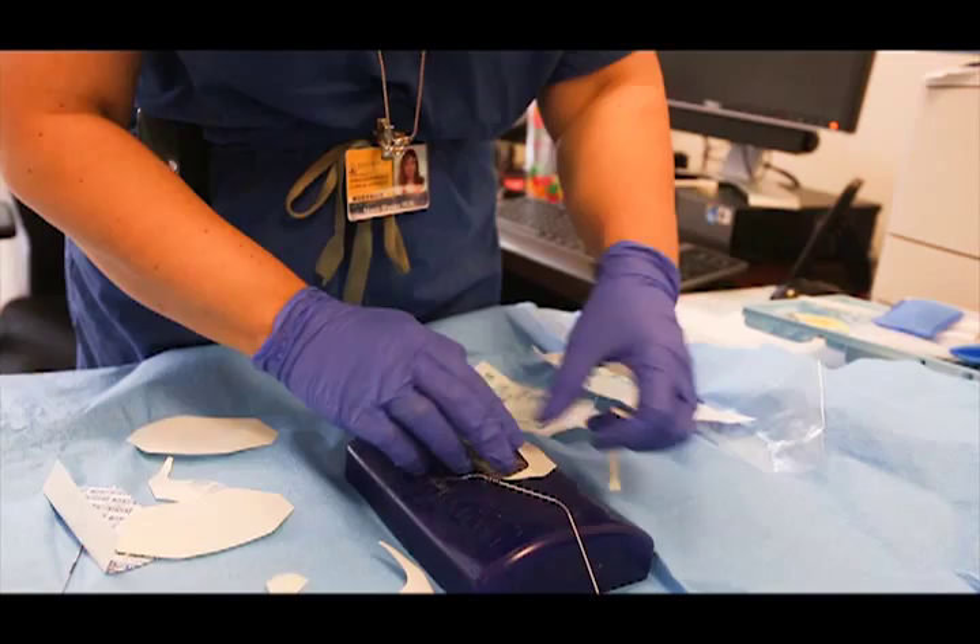And then at the end, I put the piece of Tegaderm — the SORB-A-View on top as a window if I want to, or just straight paper tape.